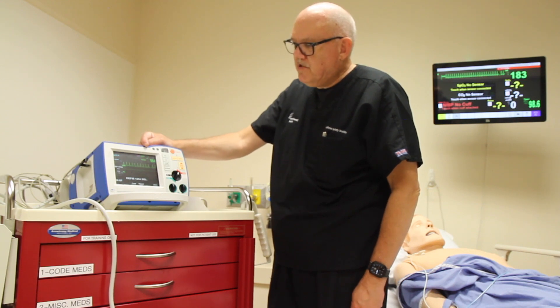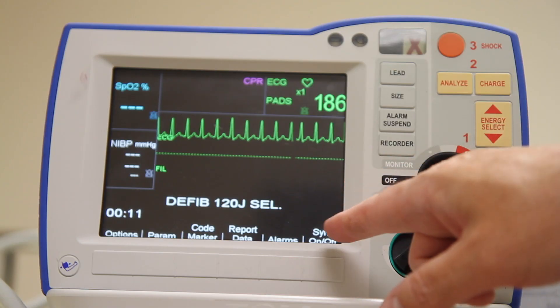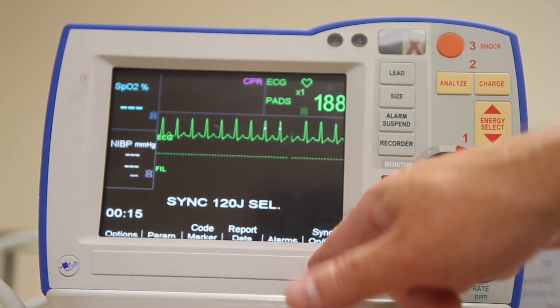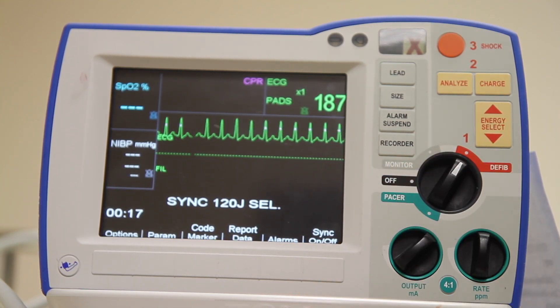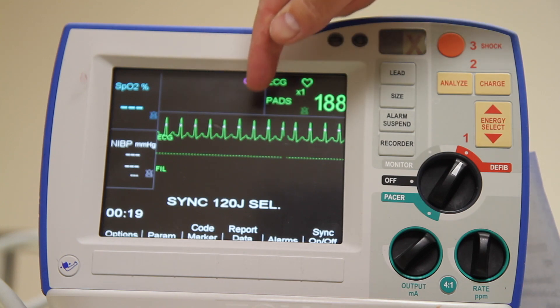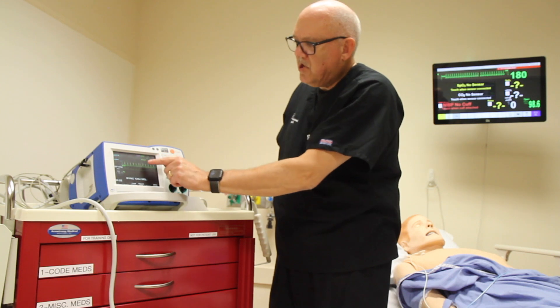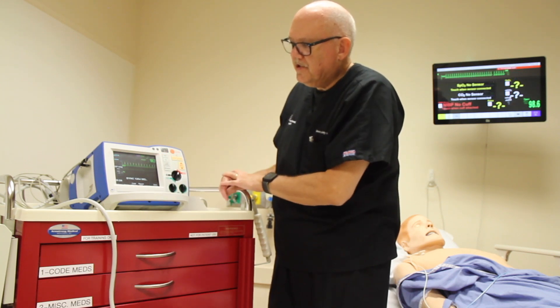Next we have to synchronize it. We're going to use the soft key at the bottom of the screen here where it says sync on off. Press the soft key and then we're going to observe for a visual indication both with the word sync and synchronization markers near the QRS complexes. Now we know it's in synchronized mode.